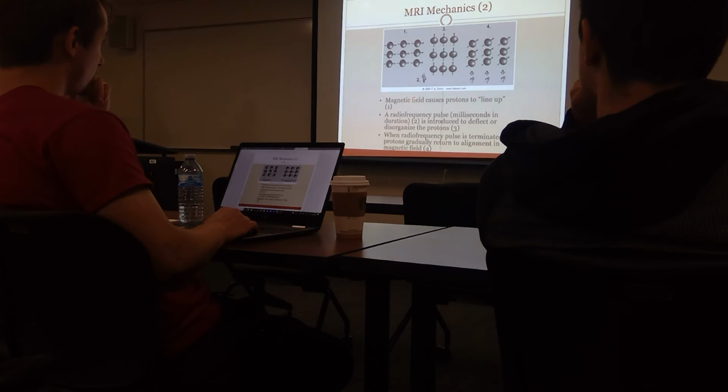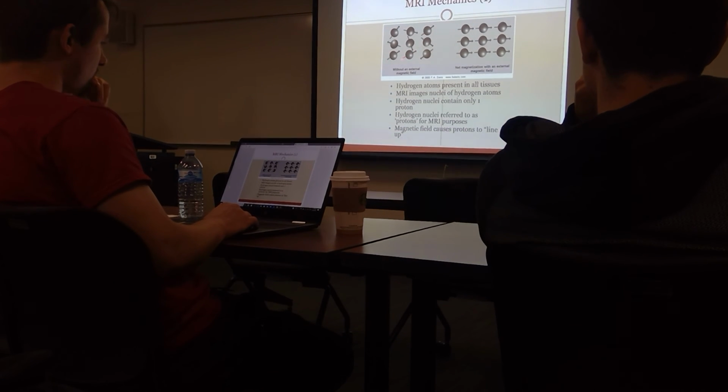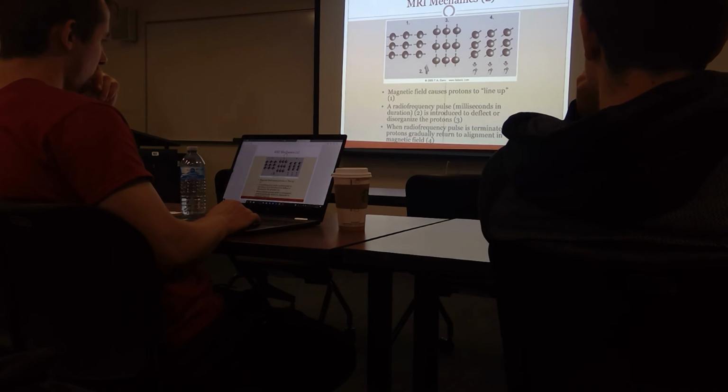So the magnetic field causes the protons to line up, because here they are just hanging out in space. Here they're lined up, and then a radio frequency pulse is introduced, which lines them up, but it also spins them on their own axes. Then you turn the frequency off, and you let these guys fall back to their normal position.